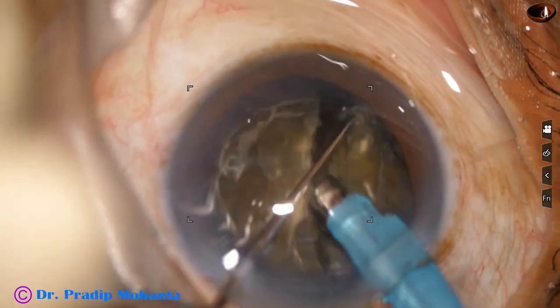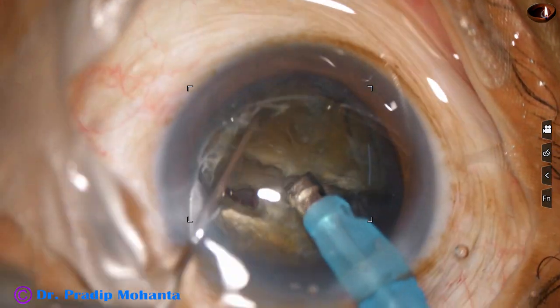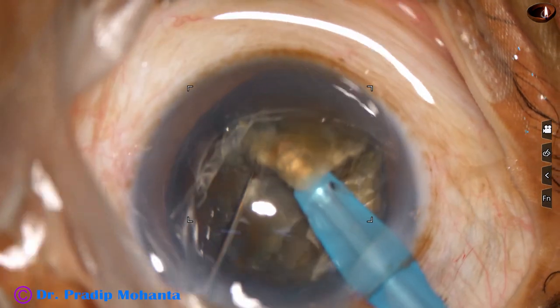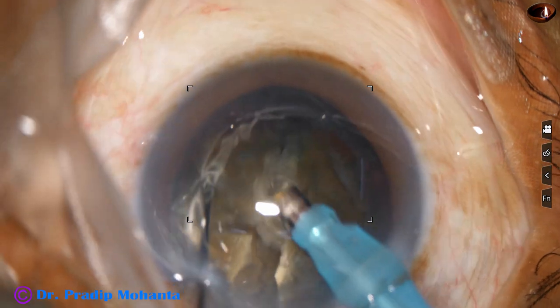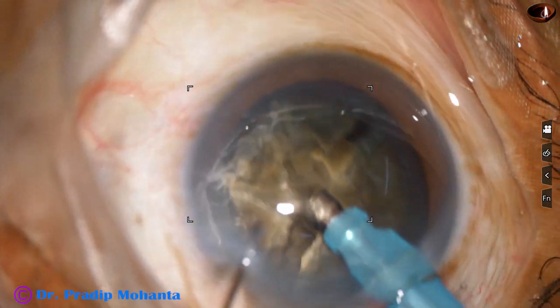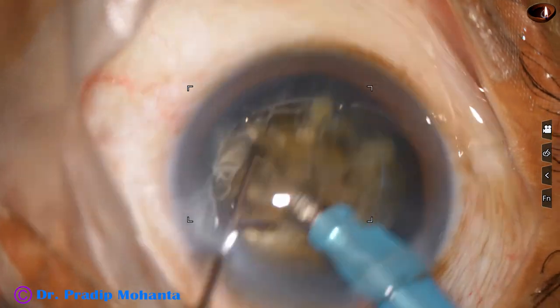And here it is. We get a nice crack at one go. No sculpting, no central groove, nothing. Just one movement and the nucleus divides into two halves. Now each heminucleus is being subdivided. And then the larger pieces are being chopped into smaller pieces.